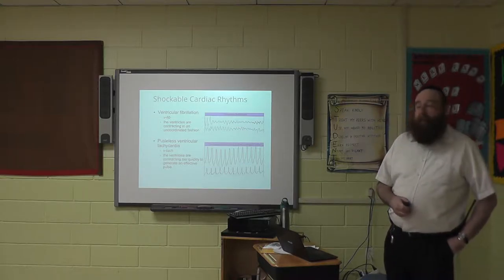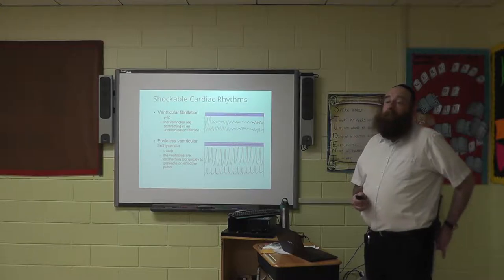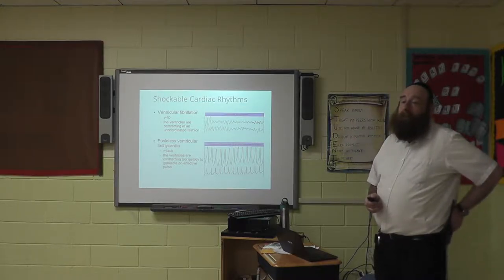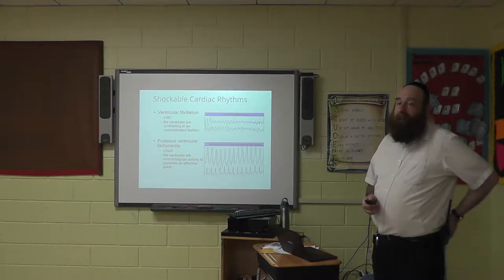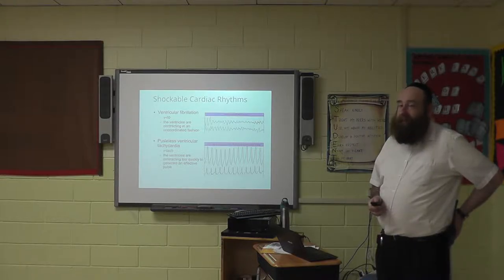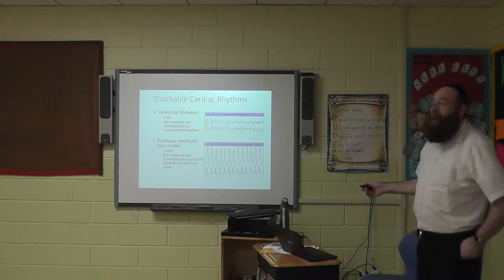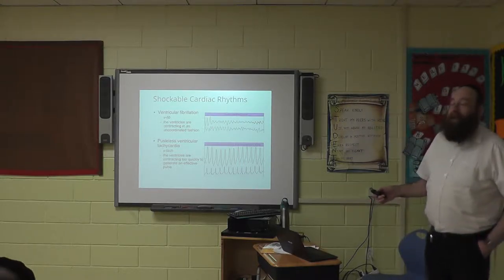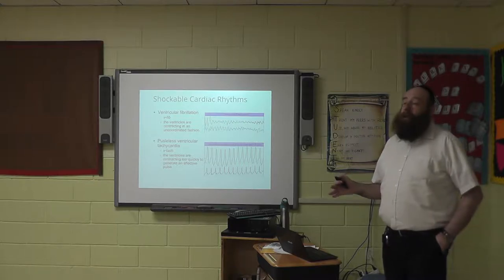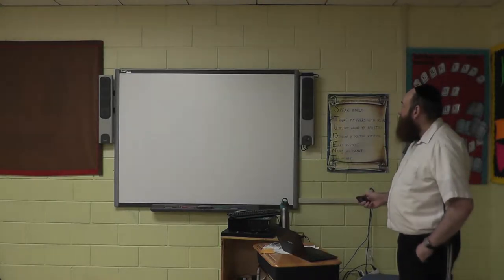The AED only reads the rhythm, and it doesn't know if there's a pulse. If someone defibrillates someone that has a pulse, that's not good. You could lose your license. If it's a regular person, they do it. It's gross negligence. That's the only time the AED could be dangerous: VTAC with a pulse.